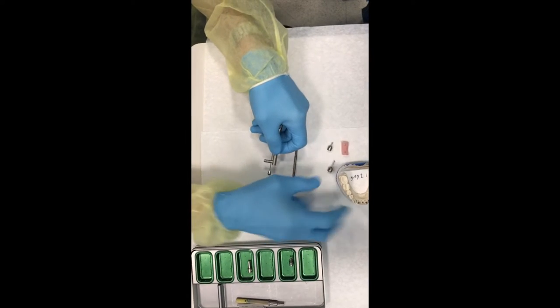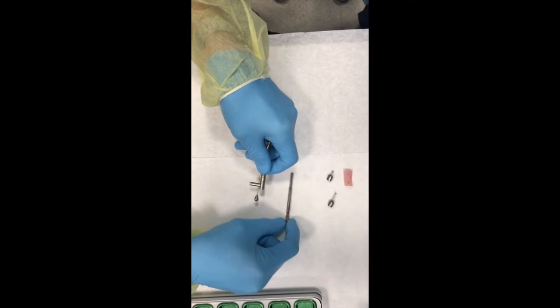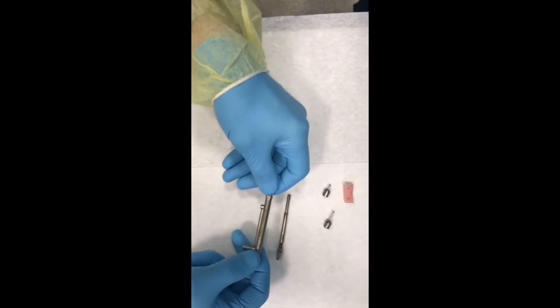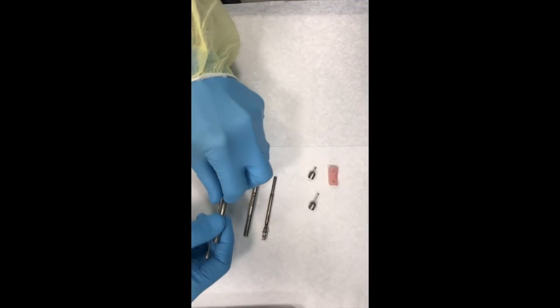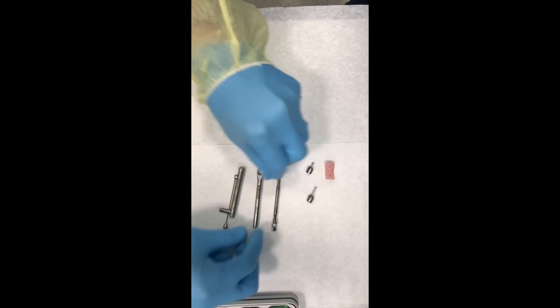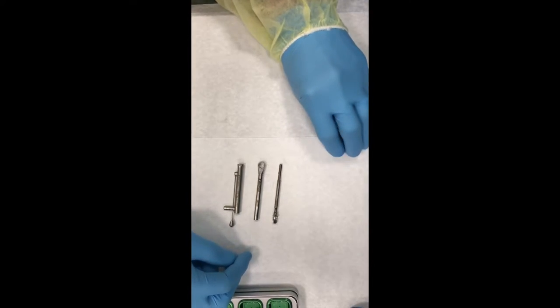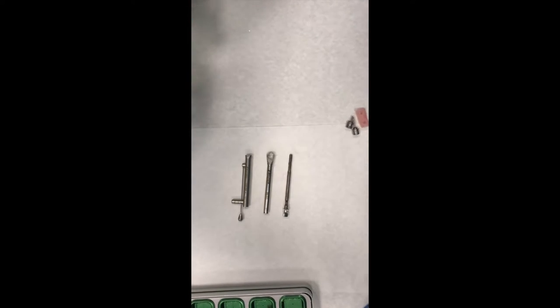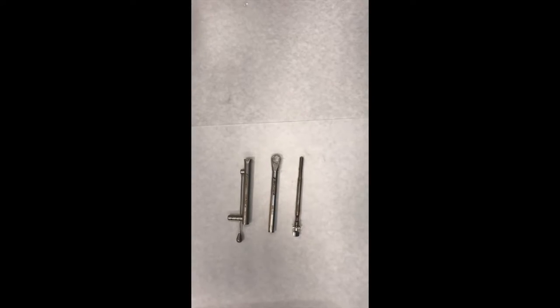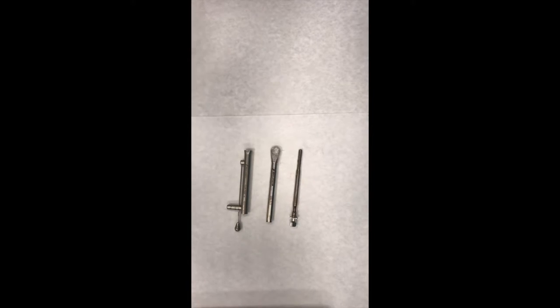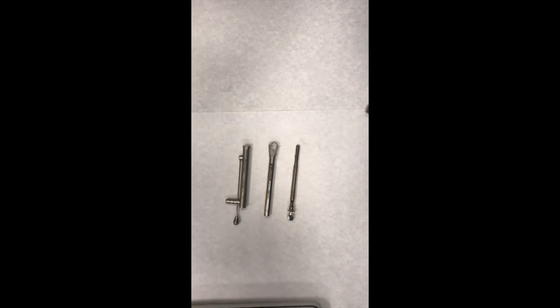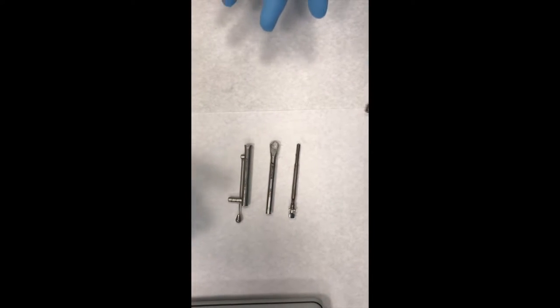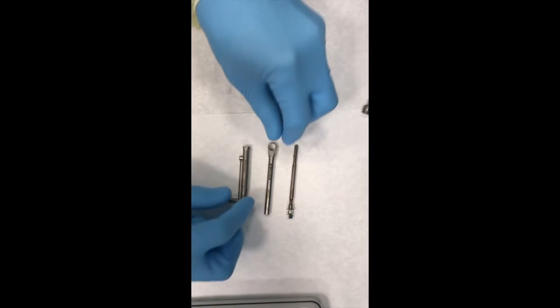I'm going to take it apart and then put it back together again so you can see what's going on here. So we're going to go ahead and remove the inner portion of it, and there's a little sheet that comes off in here, and you can see that the torque wrench now has these three components.